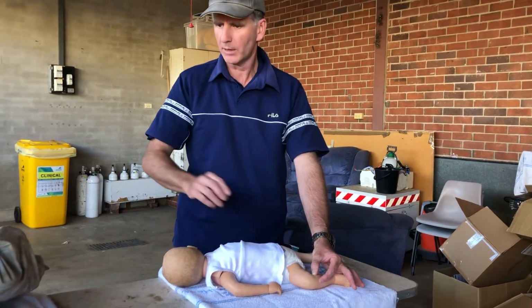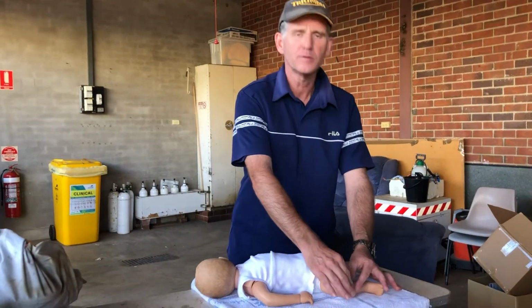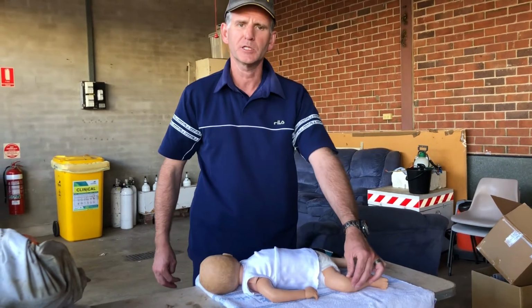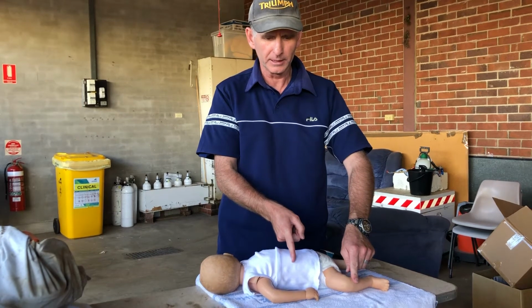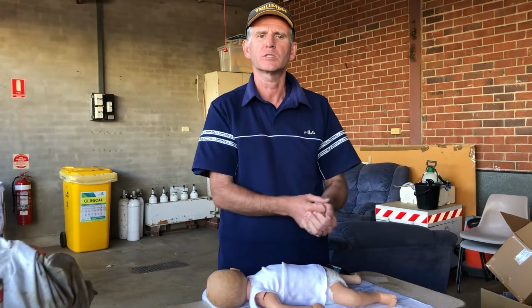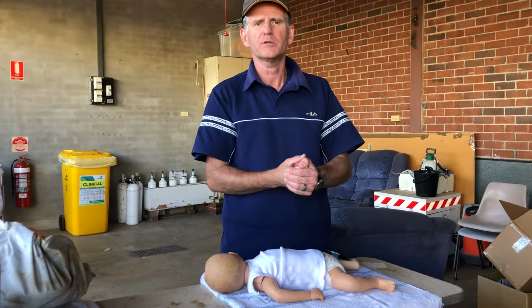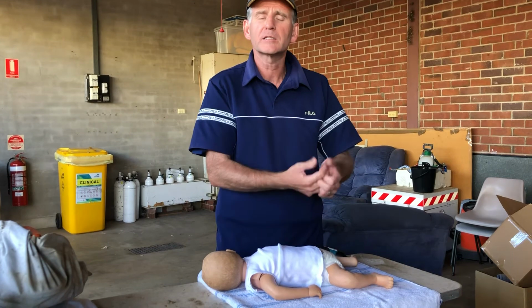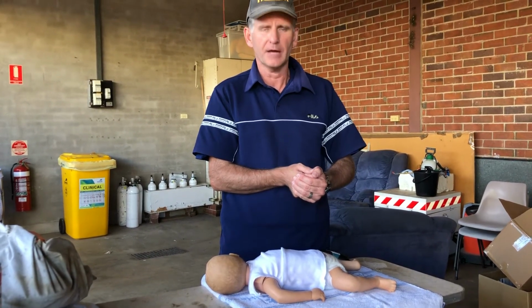Then we grab our securing tape, and we place it over the site, securing the intraosseous needle in position. We then connect our connecting tube, and with a syringe, we do a little drawback. We just pull back and see if there's any blood or marrow that comes out. It may or may not happen, and if it doesn't, then we can flush some fluids in there, and if they go in relatively easily, we might realise that we're in the cavity that we need to be in.